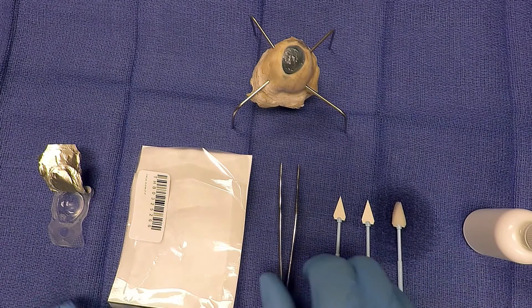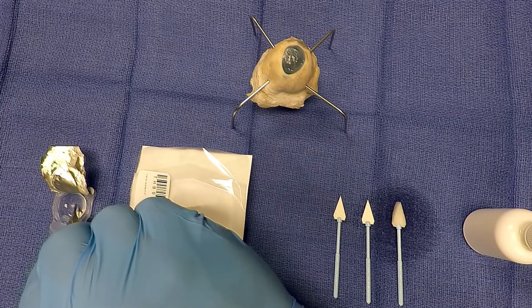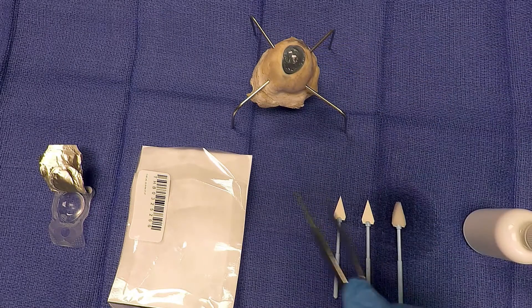Finally, take your preferred bandage contact lens and place it over the amniotic membrane to create a barrier or bandage to keep the membrane from migrating. Using the soft cell sponge, smooth out any bubbles that may be under the surface of the contact lens.